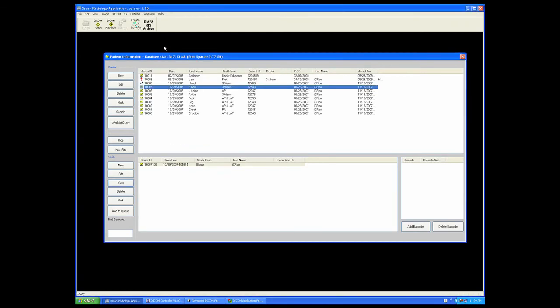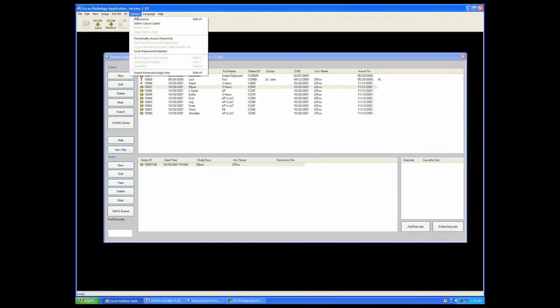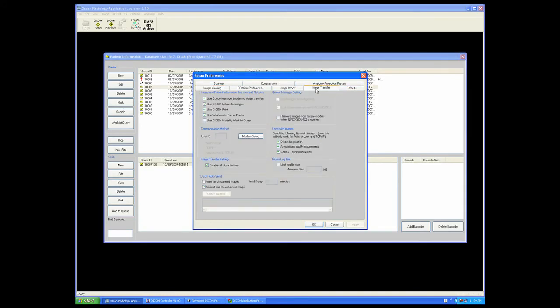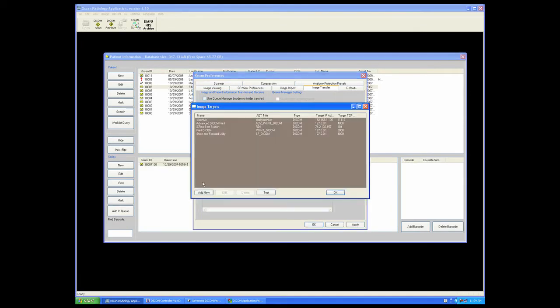Once we've listed the targets, we can now initiate an automatic send by going back to our preferences, to our image transfer tab, and selecting the DICOM auto-send function, selecting the targets we want to auto-send to.